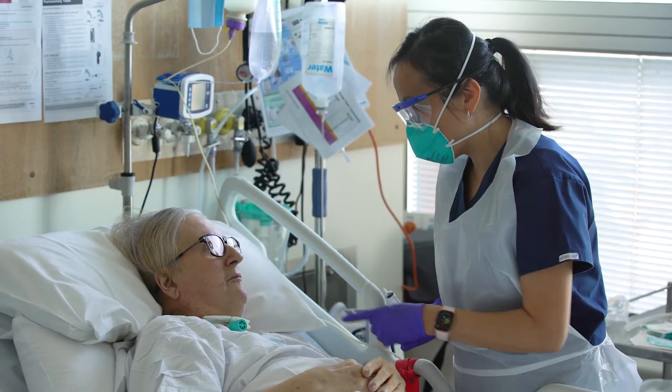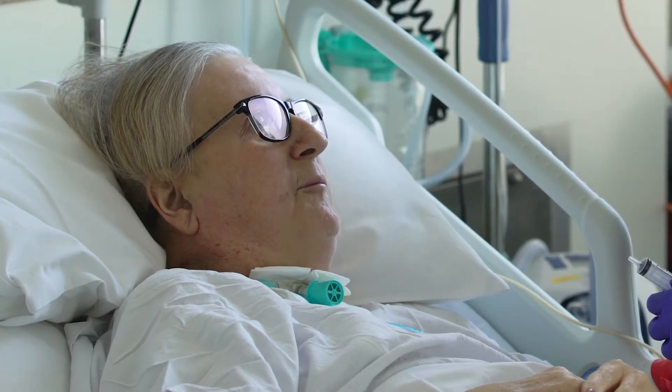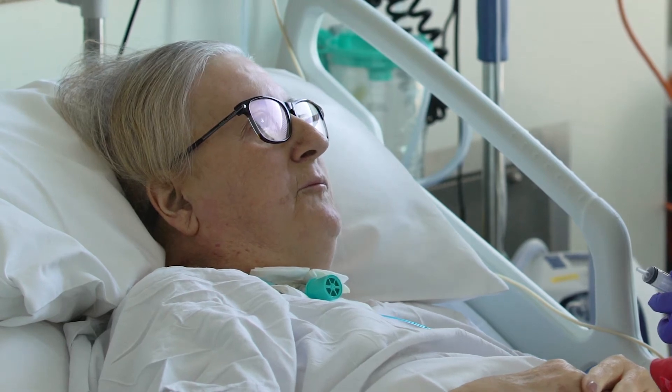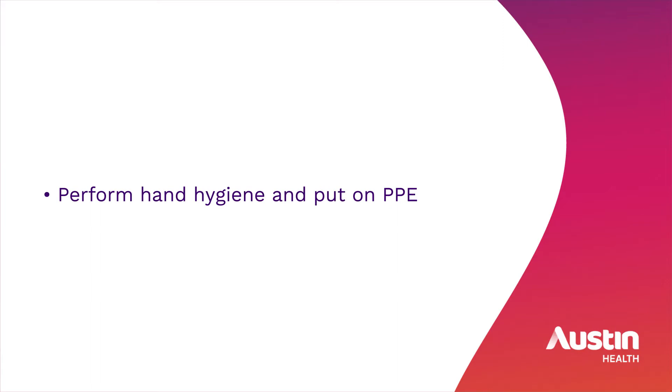Explain the procedure to the patient. Ensure that the patient is in a comfortable position. Prepare all necessary equipment. This should include tracheostomy PPE as per hospital policy, a 10ml syringe and a cuff manometer. Perform hand hygiene and put on PPE.